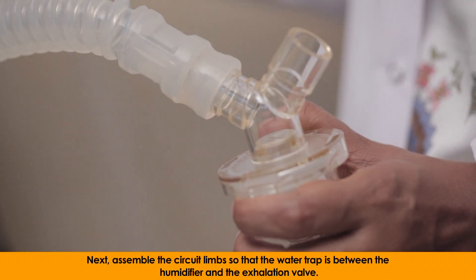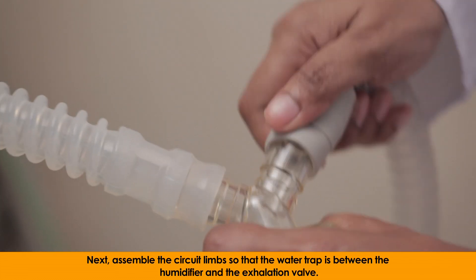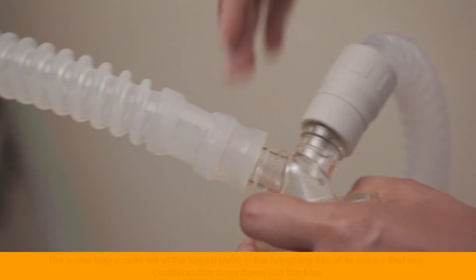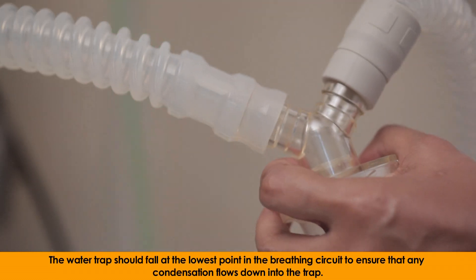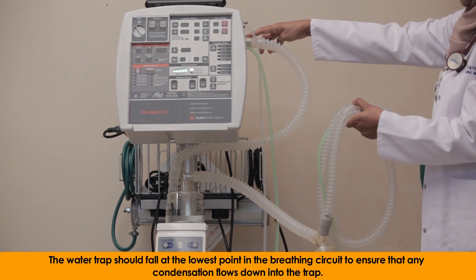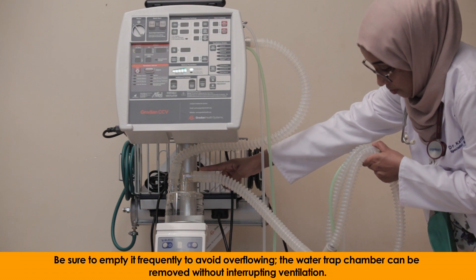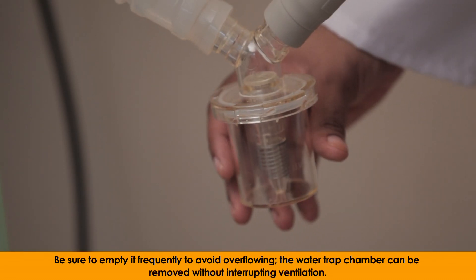Next, assemble the circuit limbs so that the water trap is between the humidifier and the exhalation valve. The water trap should fall at the lowest point in the breathing circuit to ensure that any condensation flows down into the trap. Be sure to empty it frequently to avoid overflowing.